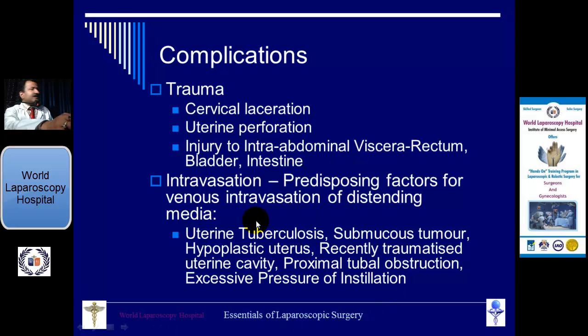Now intravasation. Intravasation means the fluid will enter into the blood vessels, and that could create different types of water intoxication, hypertension, fluid overload, or sometime hyponatremia.